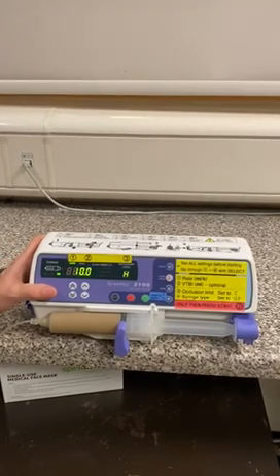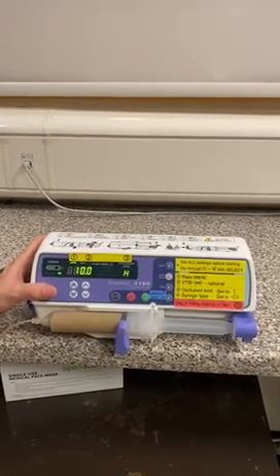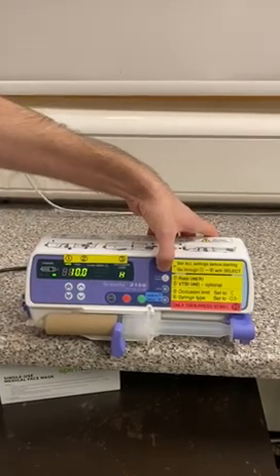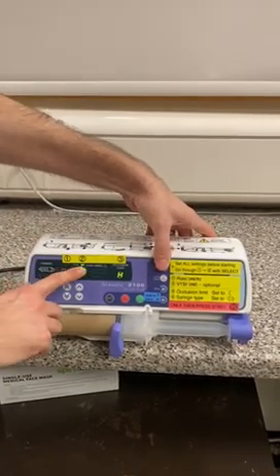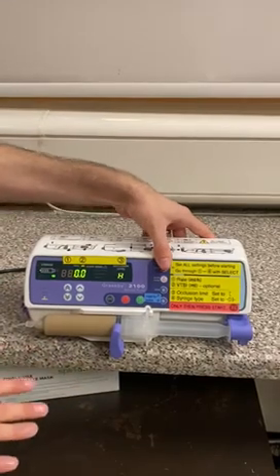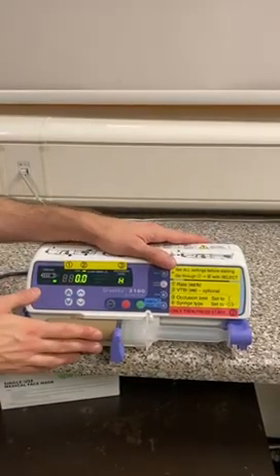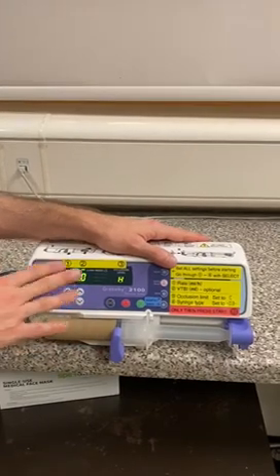The second thing we can set is volume to be infused, but this is optional. We press select again and the display goes from mils per hour to mils — this is our volume to be infused. We're going to leave this as zero because we want the infusion to be continuous, but you can set a volume to be infused if you want.